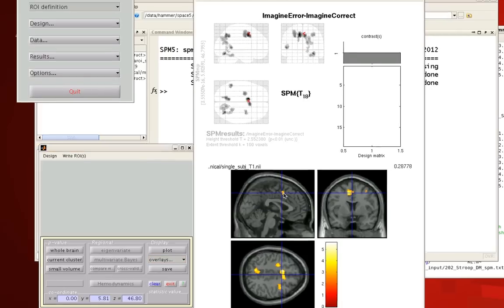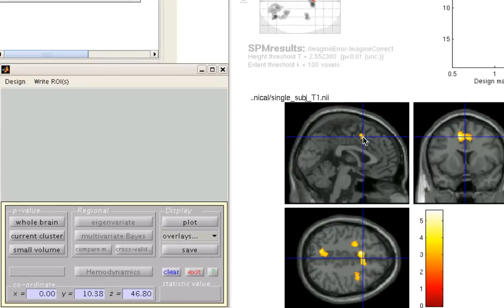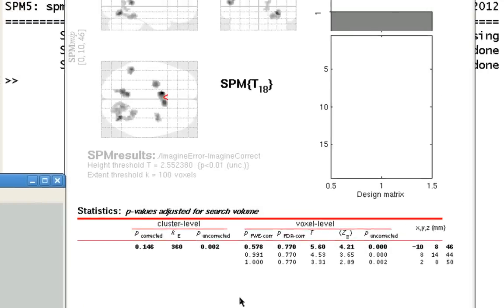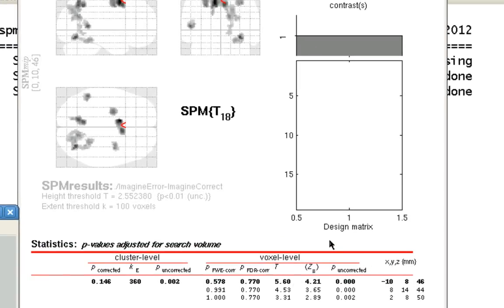And bring up this list of clusters right here. You can just click on Current Cluster after you've selected the cluster you want, and highlight the cluster in red by clicking on it here.